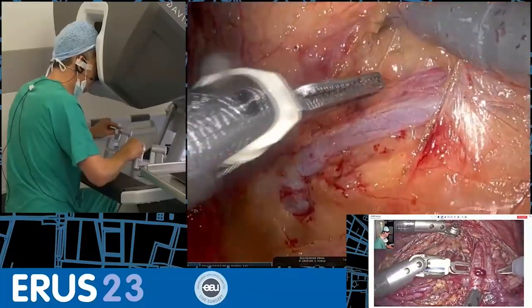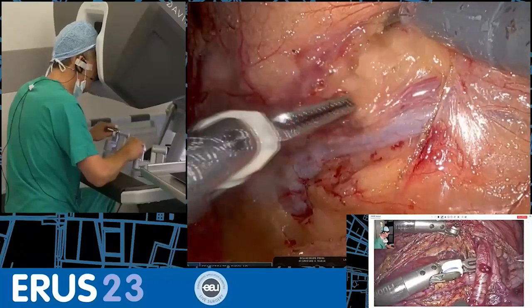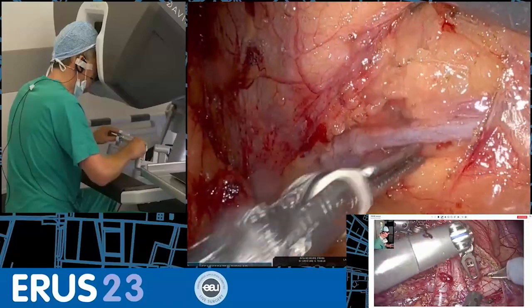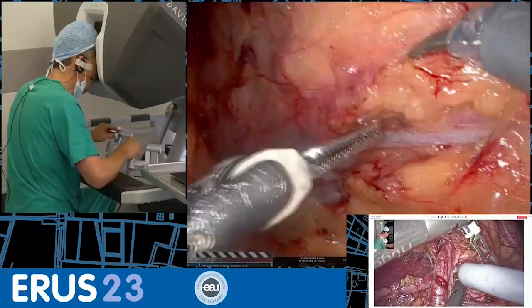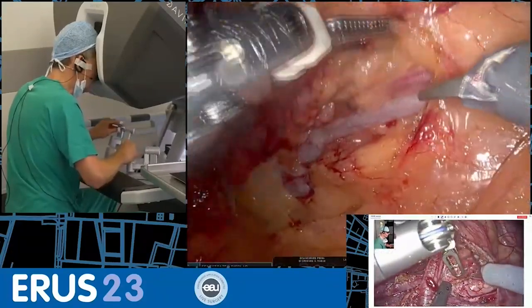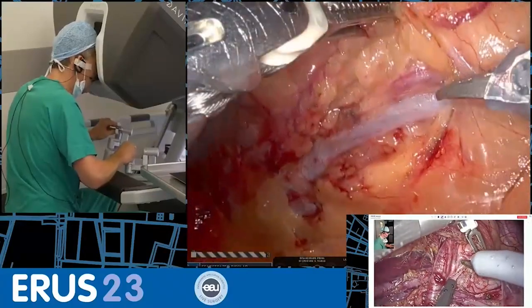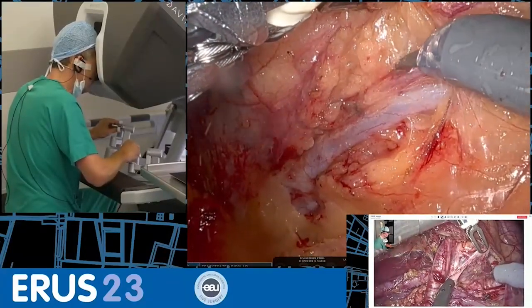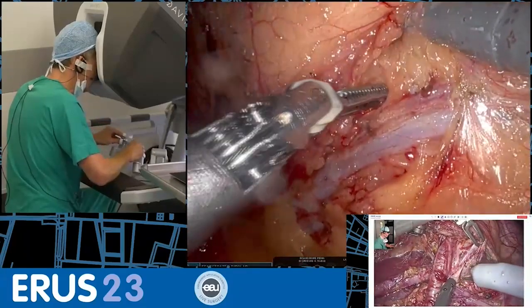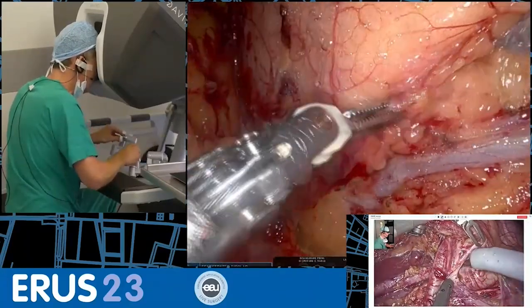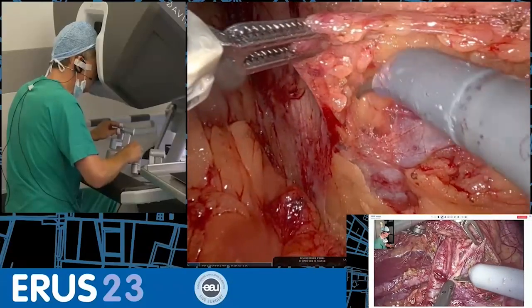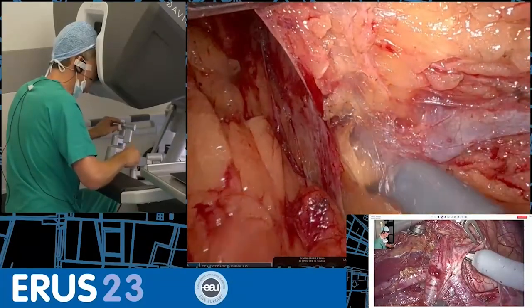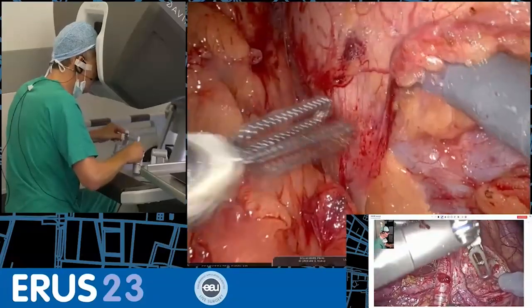This is a very good question. First of all, I think I will cut the gonadal vein. We had a discussion this morning that men feel pain afterwards, but I have never had a man who had pain after this manoeuvre. I will do this because it gives me a better view to the artery — this is what I prefer on the left side.